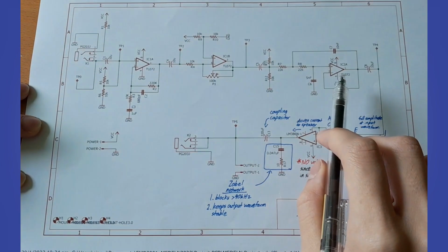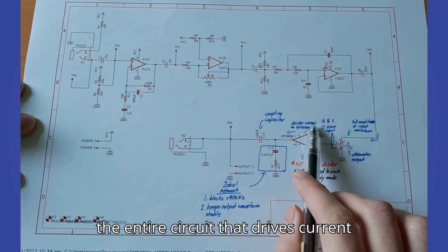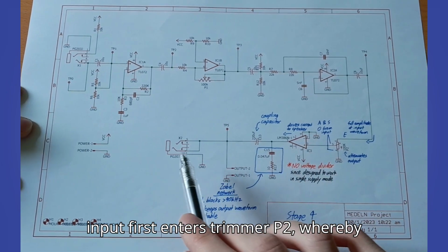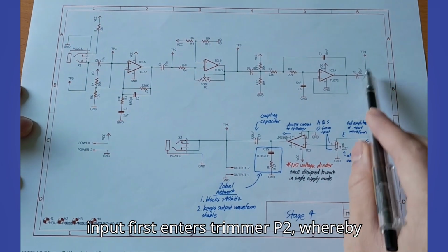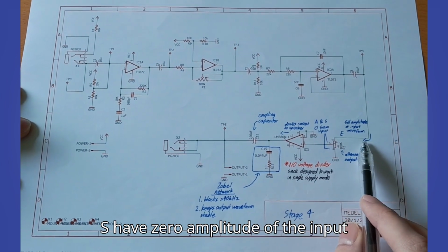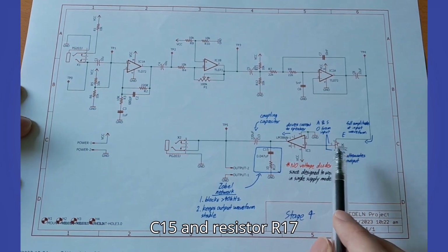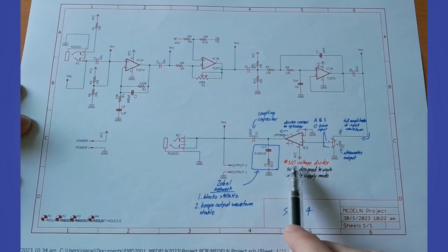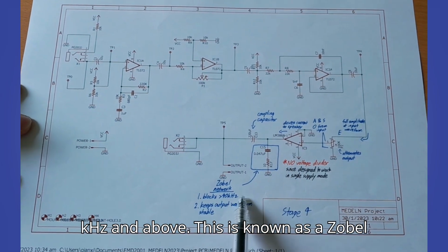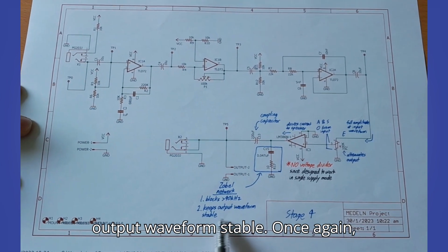Another important point, this amplifier is the only amplifier in the entire circuit that drives current that will power up the speaker. The input first enters trimmer P2, whereby pin E has full amplitude while A and S have zero amplitude of the input waveform. Capacitor C15 and resistor R17 filter out high frequencies at about 90 kHz and above. This is known as a Zobel network, and its role is to keep the output waveform stable.